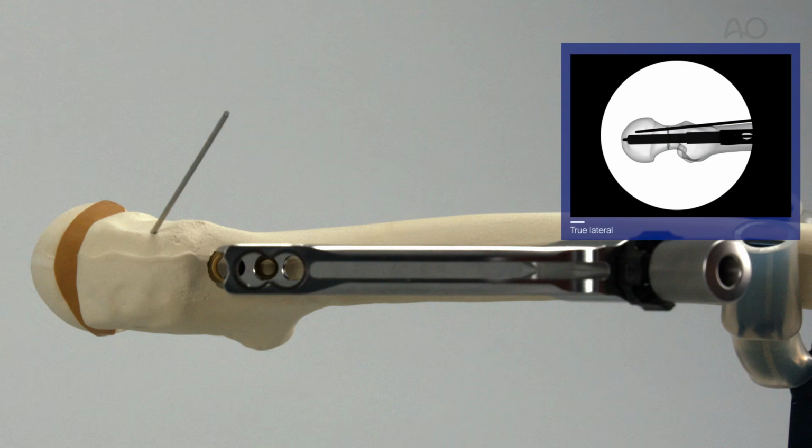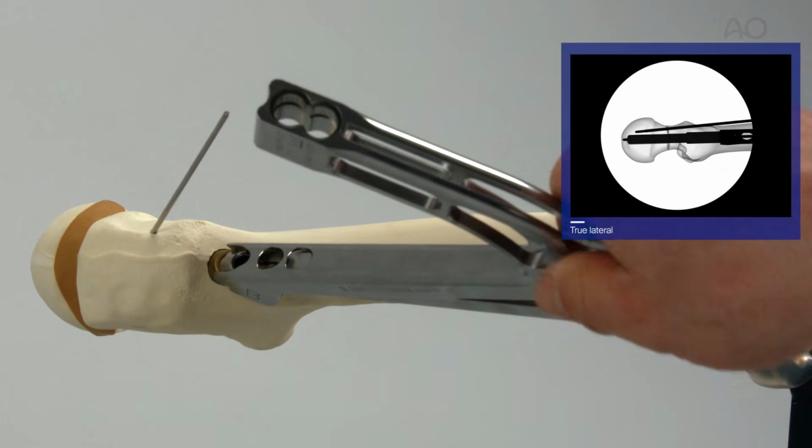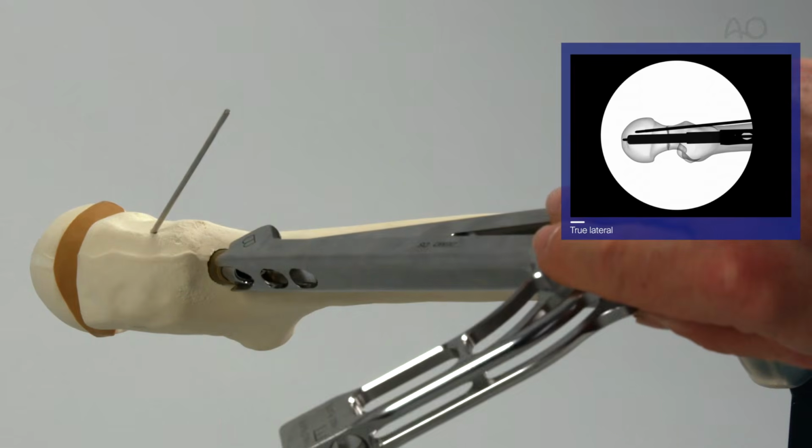Note that if the AR screw is inserted first, it is crucial that the plate is aligned to the femoral shaft prior to screw insertion. Under image intensification in the true lateral view, it is verified that the plate is parallel to the axis of the femur. If necessary, it can be confirmed by palpation. The implant and insertion instrument is rotated until it is laterally aligned, ensuring that the locking screw insertion is bicortical at the level of the femoral shaft.